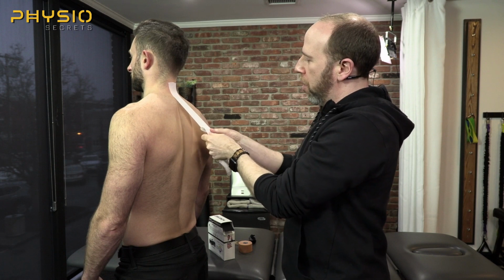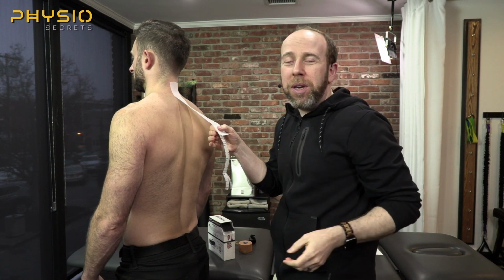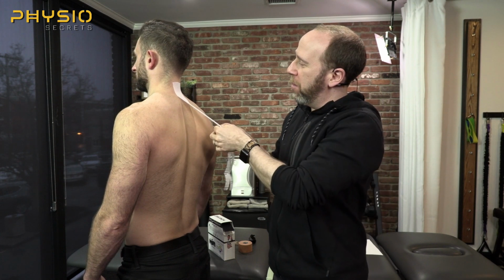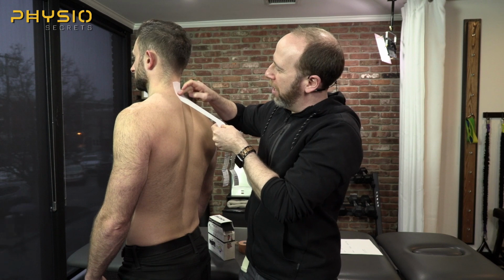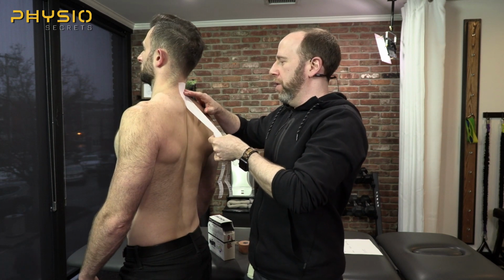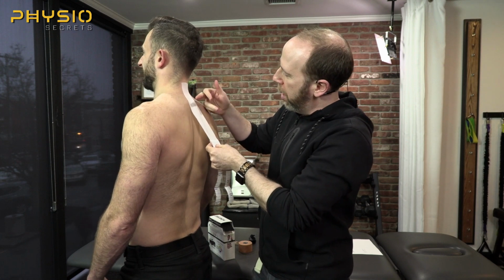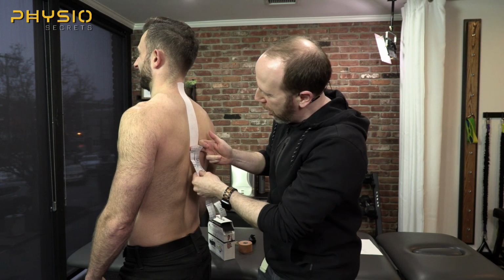Now, this is cover roll. By the way, I don't actually call this cover roll. I call it posture tape because I use this for posture taping 99% of the time. And when patients ask me what is it, I say cover roll. It's kind of a stupid sounding name, so I just say posture tape. But watch this. Okay, chest up, looking nice and good. Yeah, don't squeeze your shoulder blades back too far. Yep, I'm just going to lay this tape on with no stretch. That's the key. There's no stretch on the whole tape.